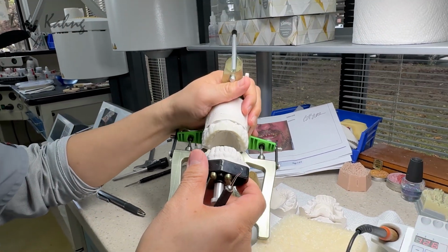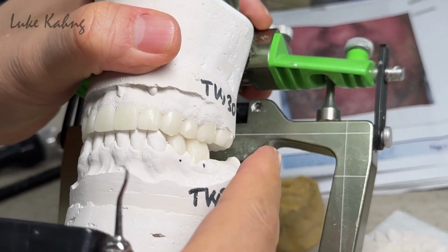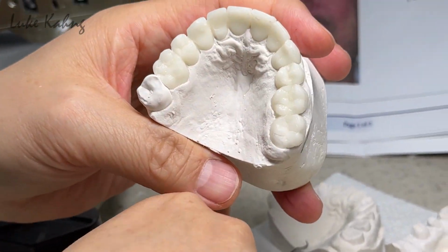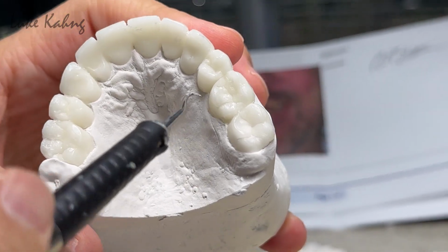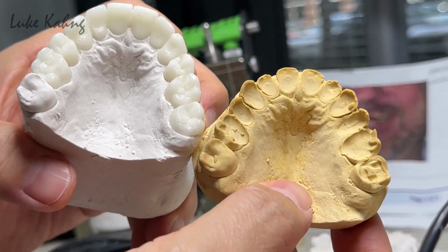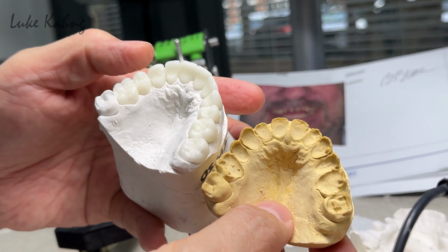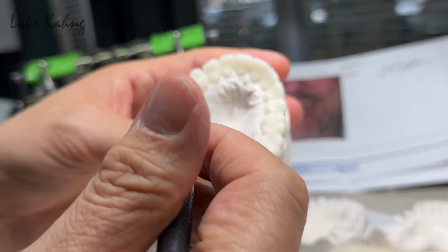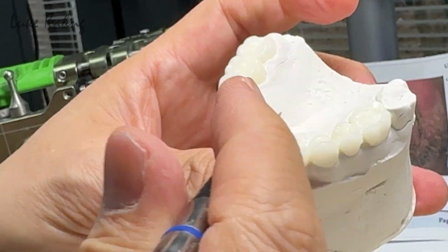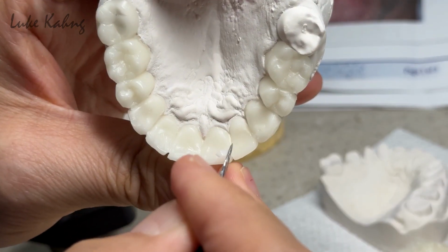Right? And then after building it, we build with the upper posterior teeth and the other posterior teeth as well. And then I'm trying to finalize it with the tools between the occlusion from here. Right? So I'm rebuilding. So I recommend this one, eventually possibly metal occlusion or full mono zirconia. And then I have to give them a little more freedom of movement when the patient is protruding.